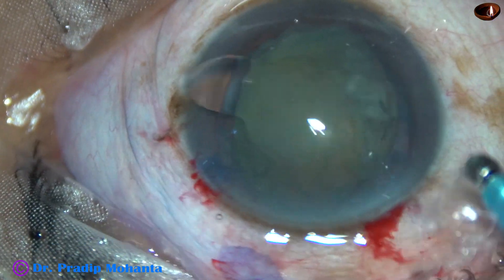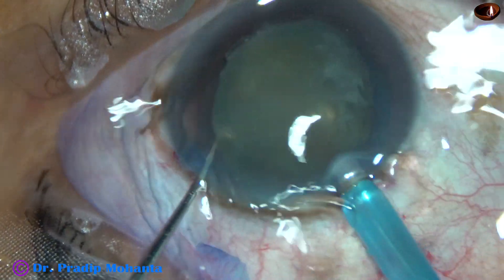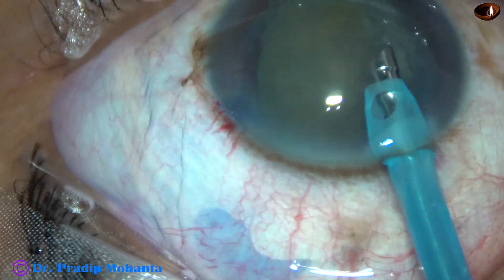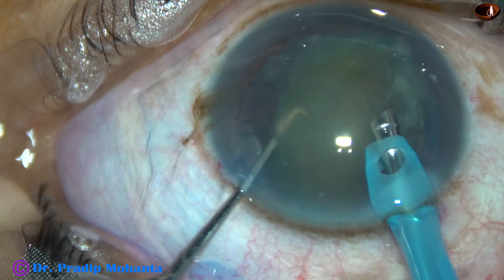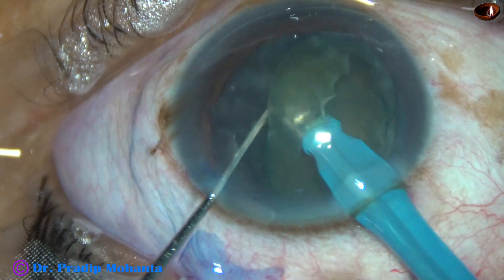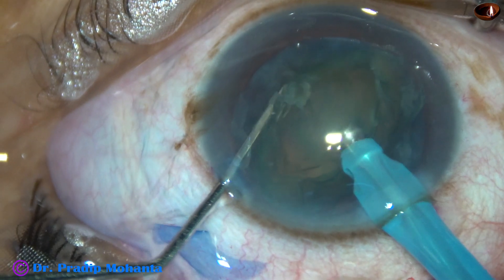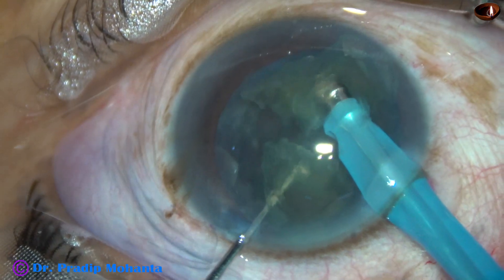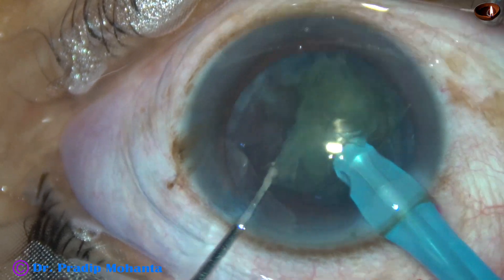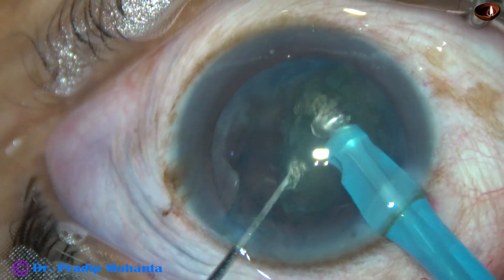The phaco handpiece is introduced and several blows are applied on the supracapsular portion — 5 blows in total — and a portion is removed. The rest of the nucleus is managed in this way.